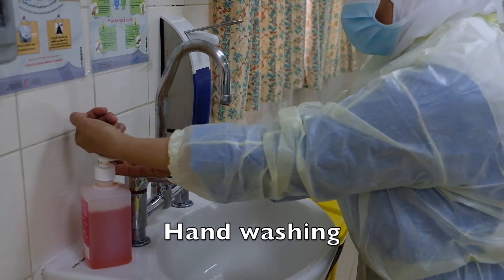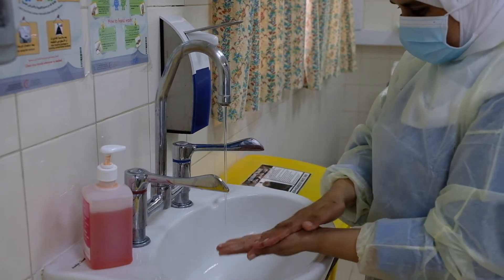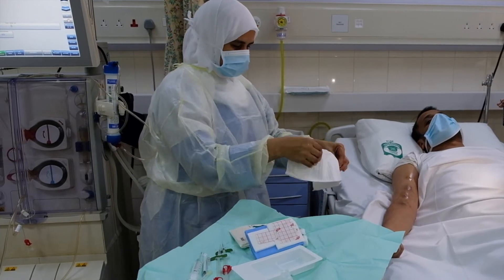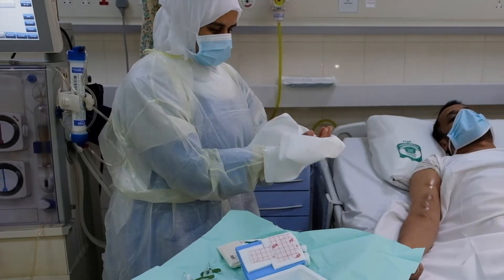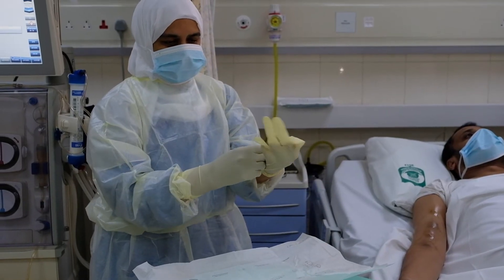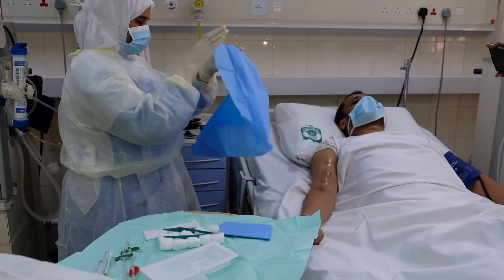Perform hand hygiene or hand washing. Dry hands using the towel available in the on/off pack. Don sterile gloves and place a sterile towel under the fistula arm.